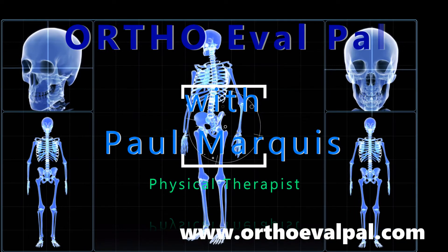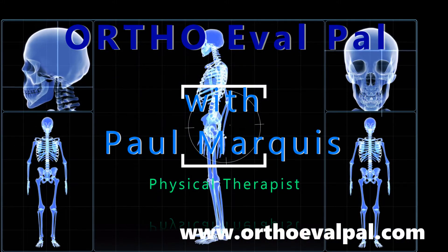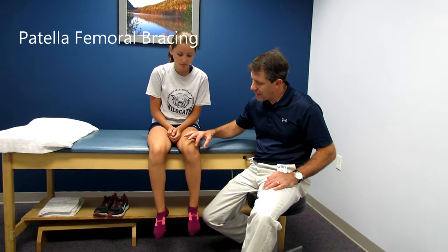Welcome to OrthoEvalPal, where we help you build confidence in your orthopedic evaluation and management skills. One of the things we like to do is patellofemoral bracing with people who have this lateral tracking patella.